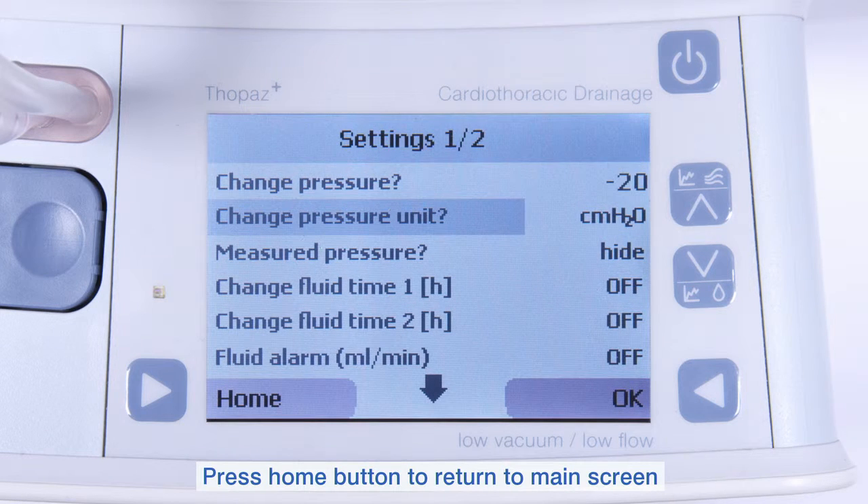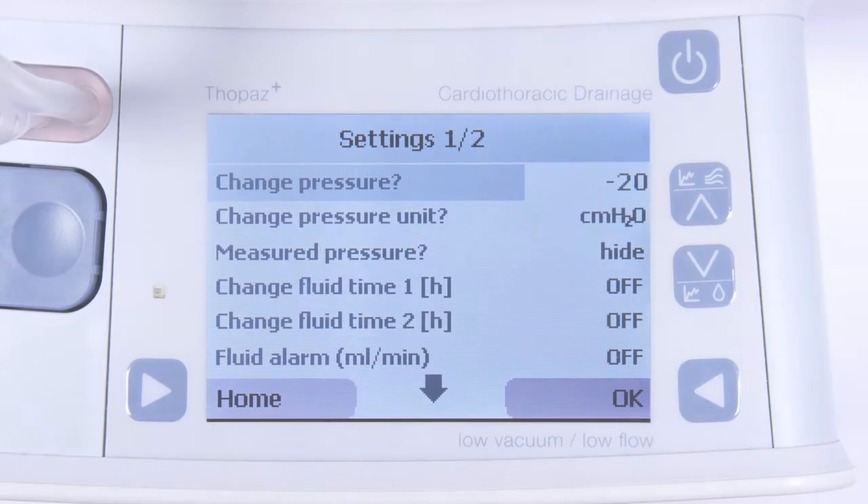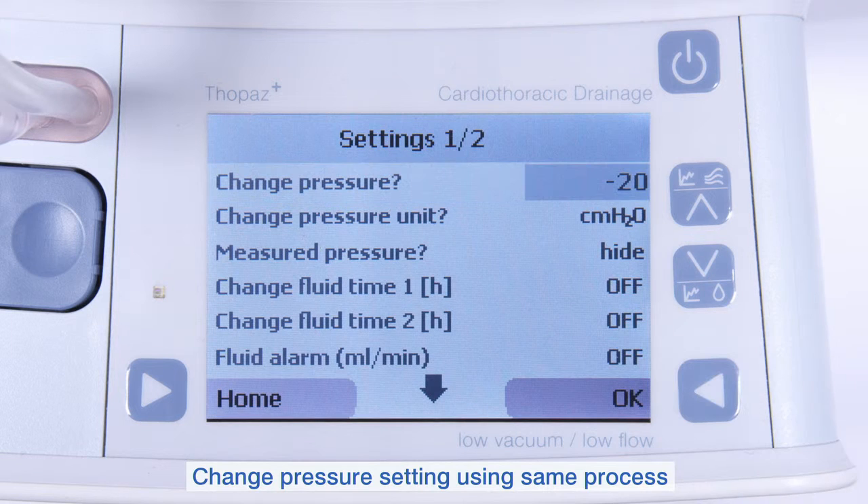Return to the main menu by pressing the Home button. To change the pressure, follow the same process.